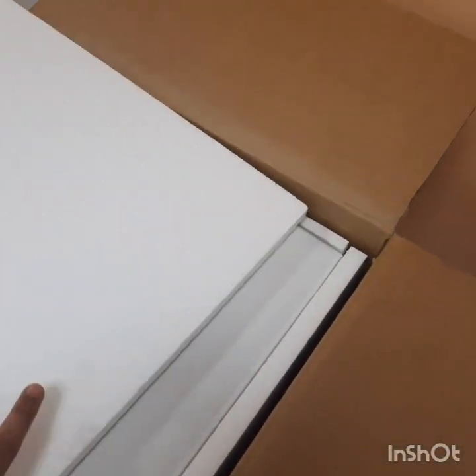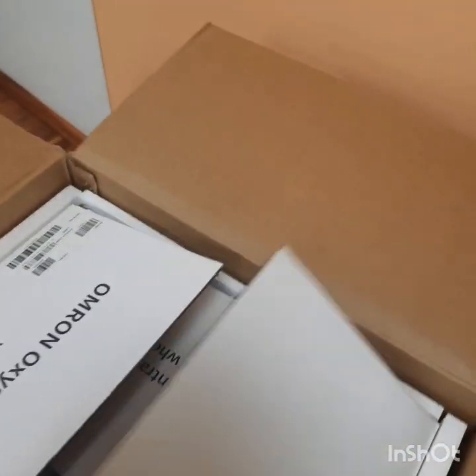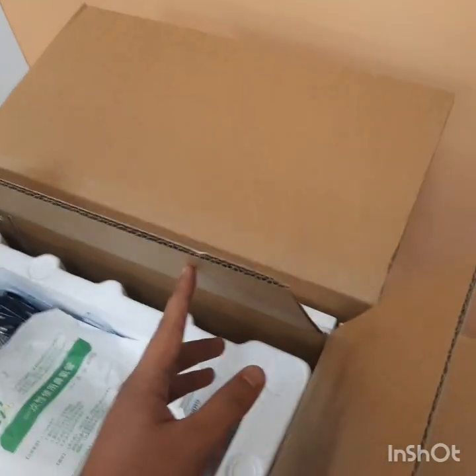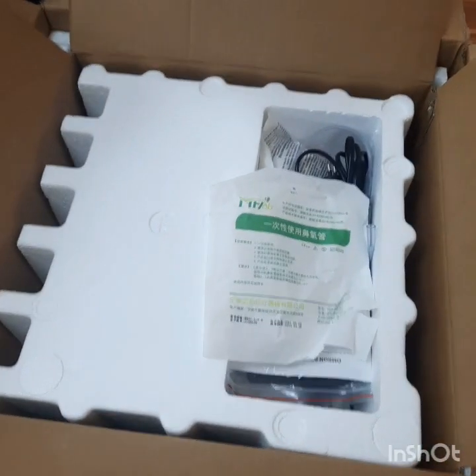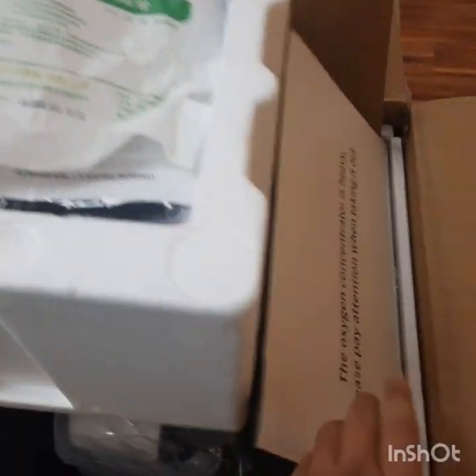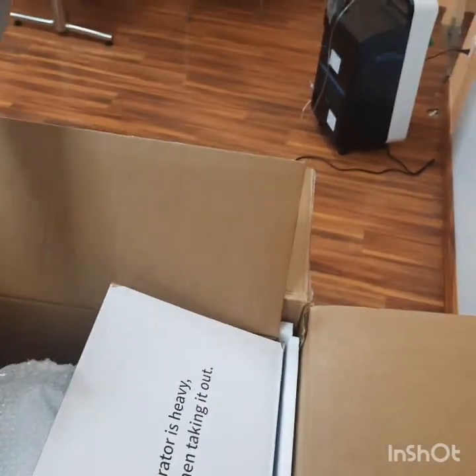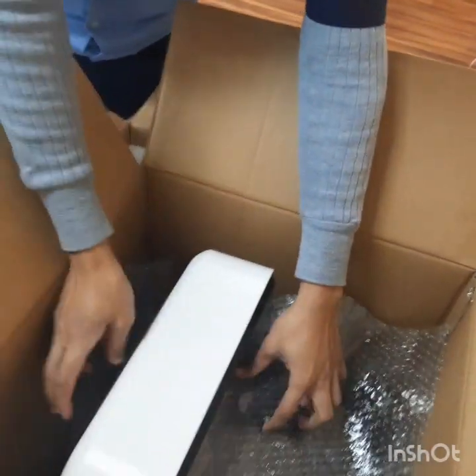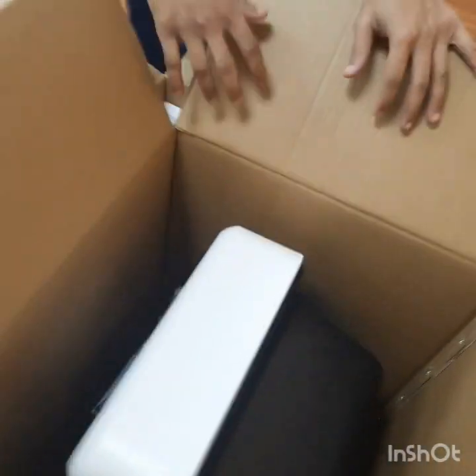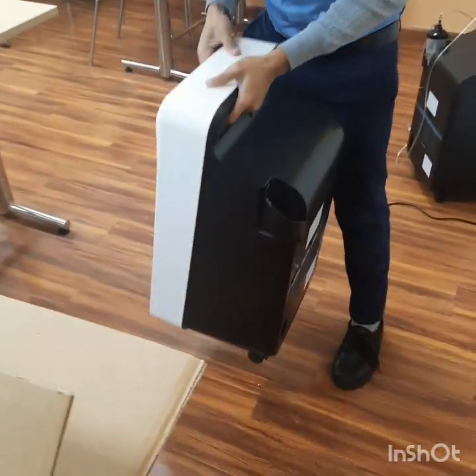Let's open the box. Inside the box, there is a serial number mentioned here. On the top, there is an accessory. We will take out the wrapping cover from the machine so that a proper grip can be achieved. While uplifting the machine, hold the box and keep the machine carefully on the floor.